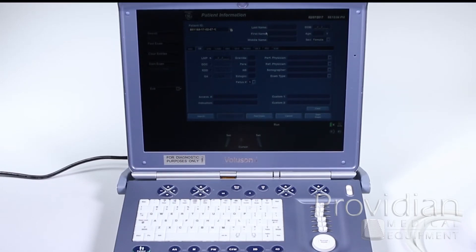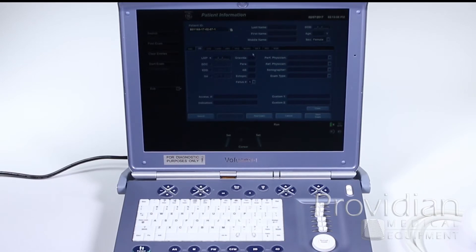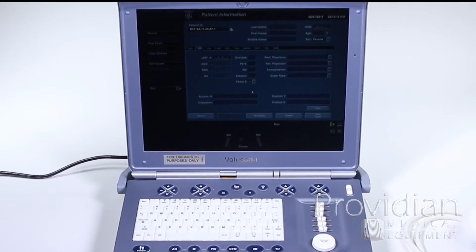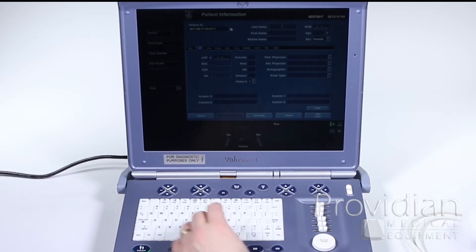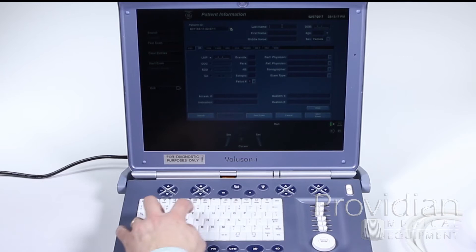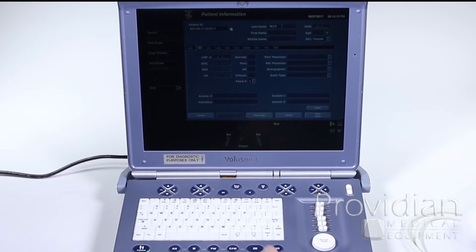Now you're going to put in your last name, first name, middle name, date of birth, age, and gender. You fill in all that information about your patient. I'm just going to go ahead and put in a test patient here to get us started. Click test and then click start exam.